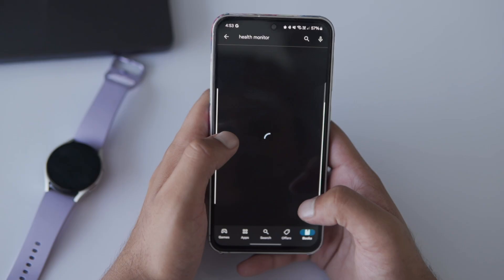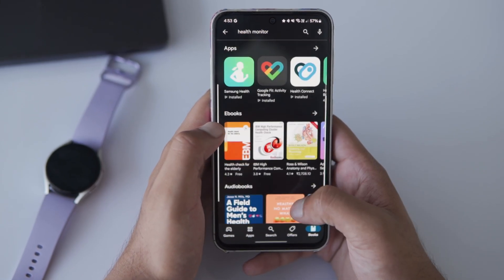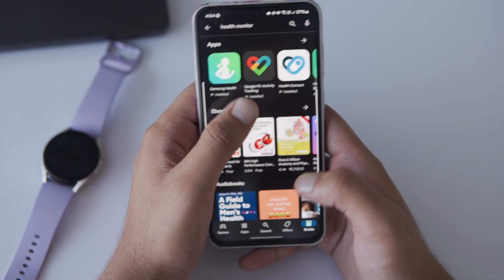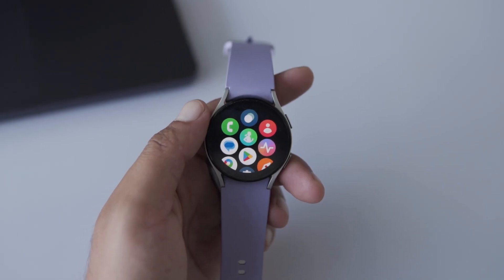Now, let's jump straight into how you can set up ECG. First things first, make sure that your Galaxy Watch is connected to your phone — this is crucial, so don't skip it. Then, you need to install the Samsung Health Monitor app from the Play Store.